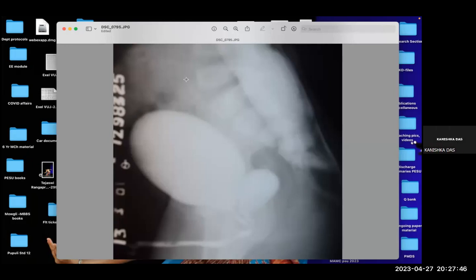What are the usual approaches we do? Can we access it from here? Yes, sir. But it's low down, below the peritoneal reflection. So we have to go deeper there to access it. It's possible. Both by laparoscopy and laparotomy, it's possible. That's one. Where else?